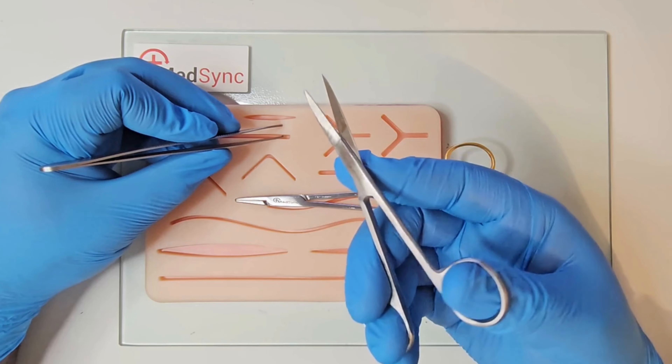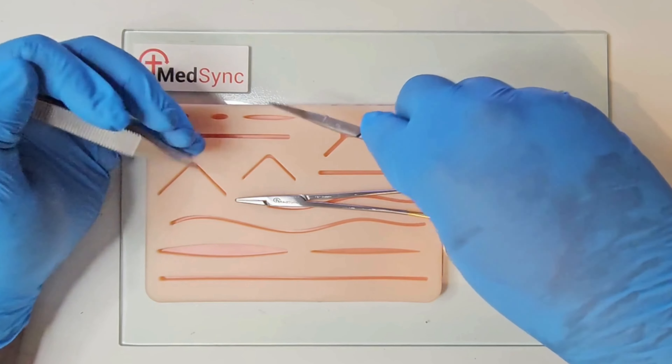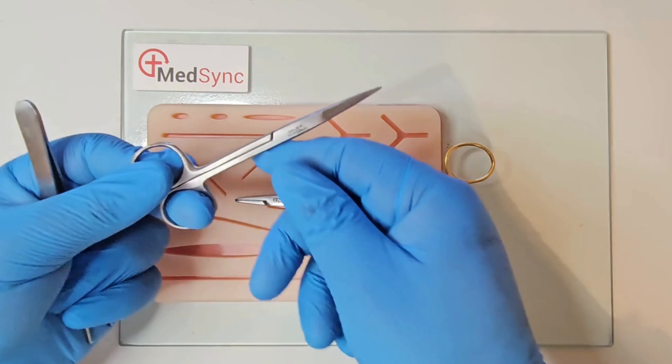Scissors are mounted by ring finger and thumb, index extended, and you cut with the tip. To use your left hand, index and thumb grasp one ring, and the pulp of the middle finger is placed against the other. Opposing force opens the scissors; bringing the rings together will allow you to cut.